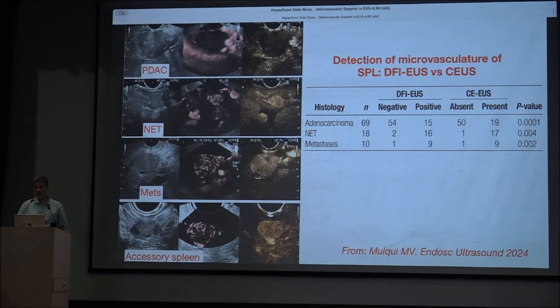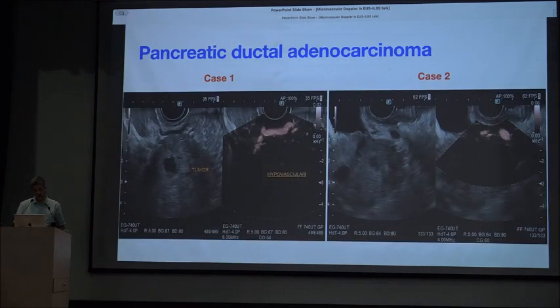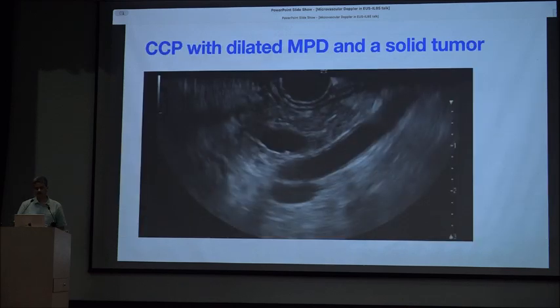This study from Mulki, from Marc Giovannini's group, also showed that DFI had excellent concordance with contrast US, and all of these 107 retrospective patients were operated. This is a couple of our patients. We see the same thing. These are pancreatic ductal adenocarcinomas, all biopsy proven. So you have hypovascularity demonstrable on DFI modes.